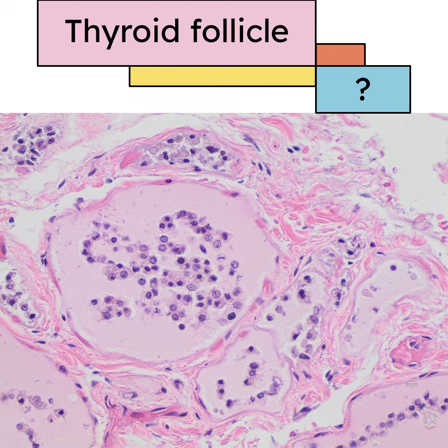The microscopic examination of thyroid parenchyma obtained during postmortem analysis frequently reveals autolytic changes that can confound the histopathological diagnosis if not properly distinguished from true intravital pathology. In this hematoxylin and eosin stain section, the most prominent feature is the widespread sloughing of thyroid follicular cells into the follicular lumens. These cells, which normally form a tidy cuboidal or columnar epithelial lining resting on a basement membrane, have detached due to the degradation of intercellular junctions and adhesion molecules following somatic death.